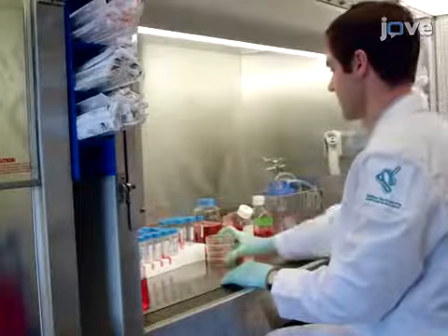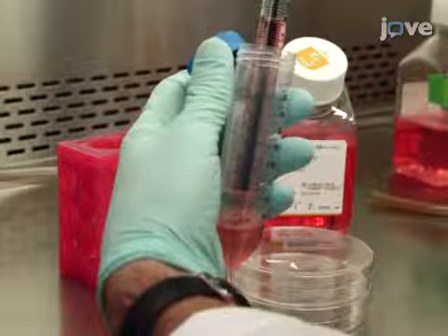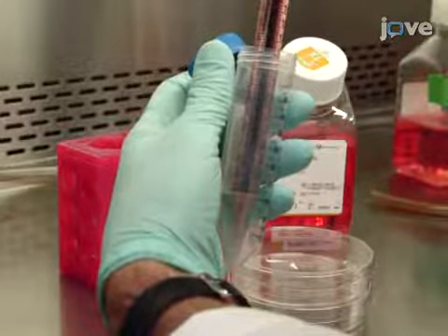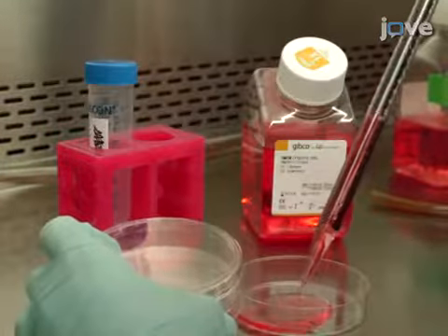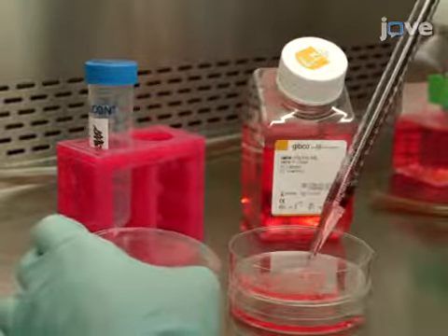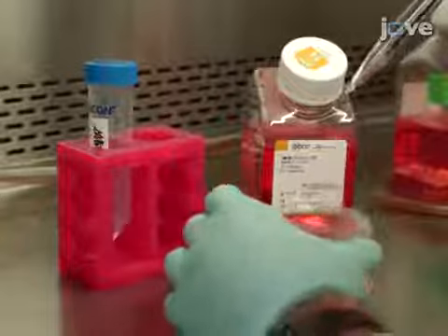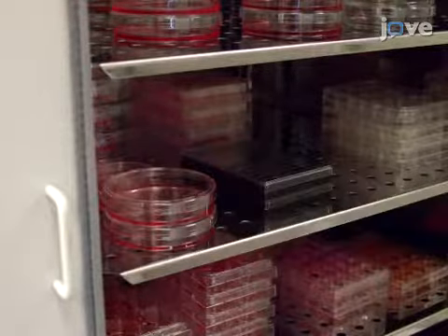After aliquoting and freezing gelatinous protein, thaw and resuspend a 1 milliliter aliquot in 19 milliliters of DMEM F12. Then, introduce 5 milliliters of this mixture onto a single 10 centimeter tissue culture dish. After preparing several such plates, proceed to incubate them for 1 hour at room temperature.